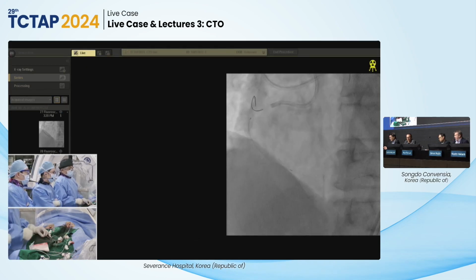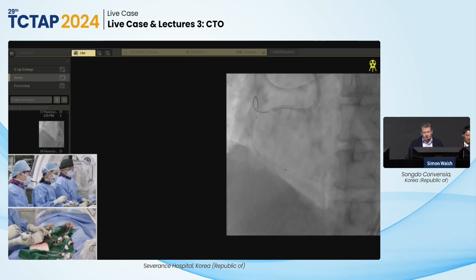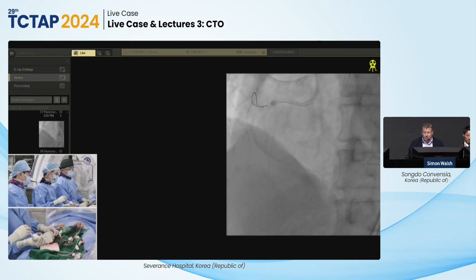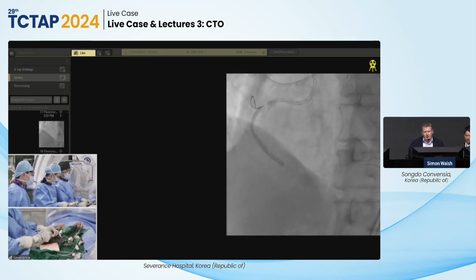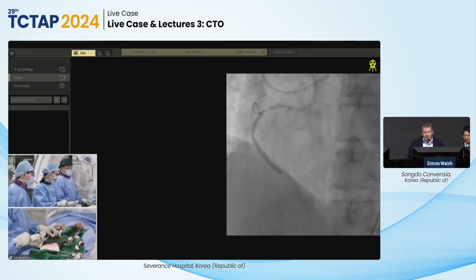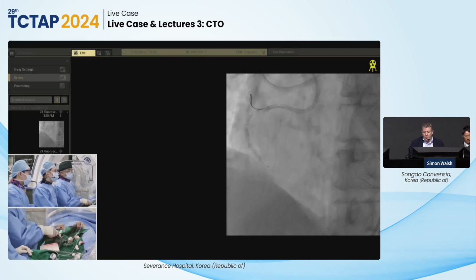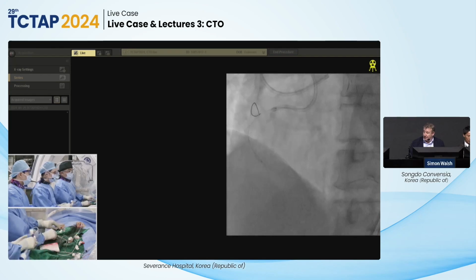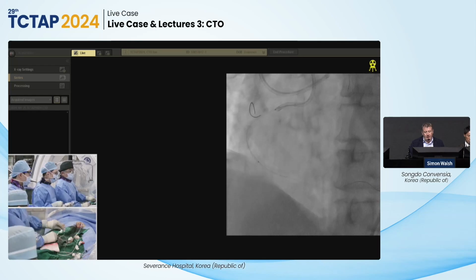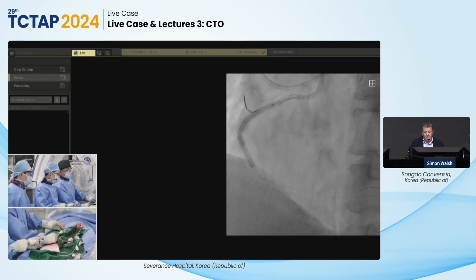Yeah. I think if you have eccentric or nodular calcium, I would have a relatively low threshold to consider atherectomy for nodules. I think it's probably the most likely thing to modify them properly. This is maybe just a lower pressure balloon expansion that's not popping that lesion. And I'm sure an NC will do the thing. I think the key thing is to understand the IVUS before you commit to the stent, because when the stent's there, it's too late. So you need to be certain of what you're dealing with before you put the stent in. That's the most important message.